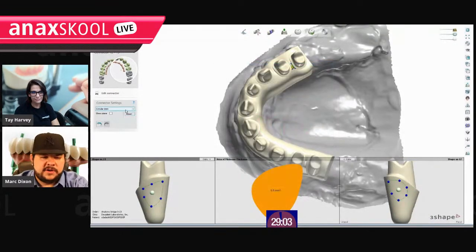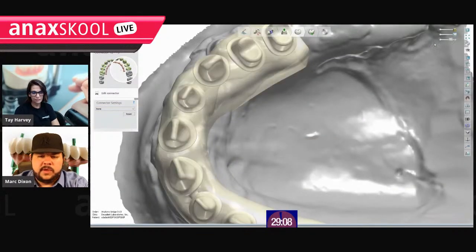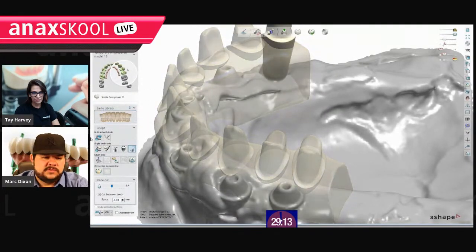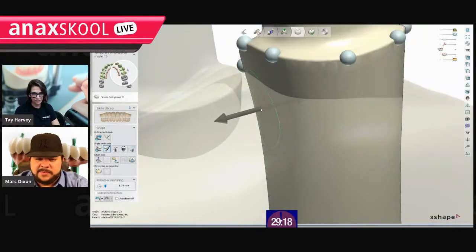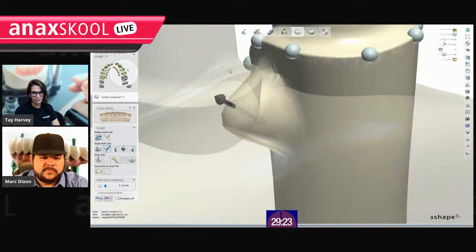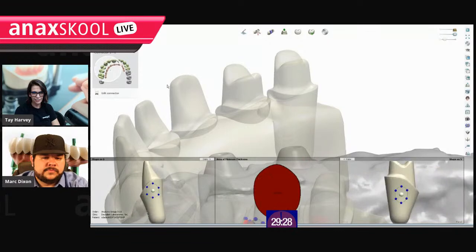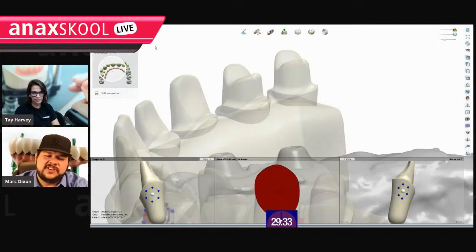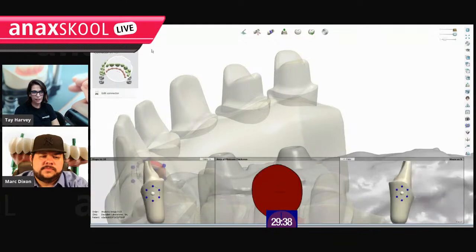So we're going to get rid of the connector. Okay. We're going to say no. And we're going to go in here. I just want to see this one. Get rid of everything else. We're going to grab a piece of skin and we're going to pinch it and pull it over. Okay. So they're touching. Now they're touching. We should be good to go. It's not going to give us the. Interesting. But sometimes you can't do that. And you're like, there's nothing to grab or pull or stretch. And you're just like, you son of a gun.